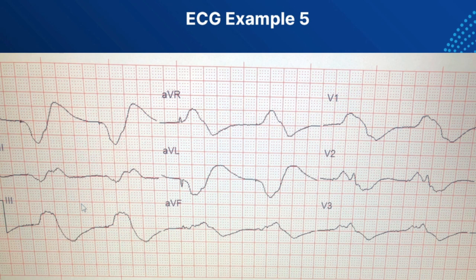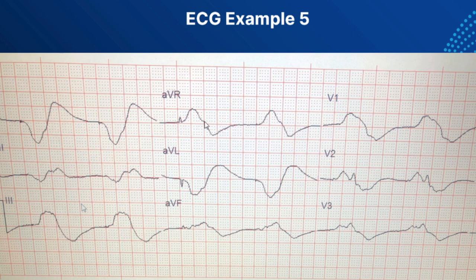ECG Case 5: this patient was found unresponsive by his wife — no dialysis or anything like that. The 12-lead is extremely wide. This is one of the most severe cases of hyperkalemia I've had. It's the kind of 12-lead that makes anyone look to the sky and hope all the leads are on right. But all the leads were on correctly — this is not artifact. This is very extreme hyperkalemia. You can see the sine wave here, very bradycardic.